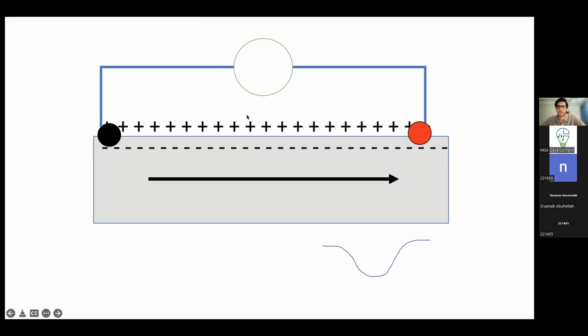Yes, it's clear. Great. The deflection is the line on the ECG. Exactly, it's the trace on the ECG.